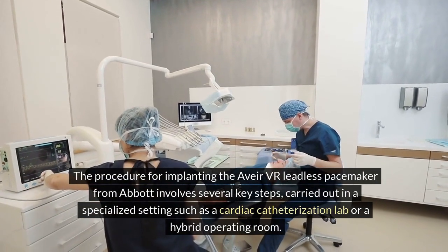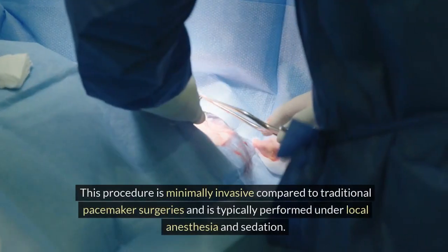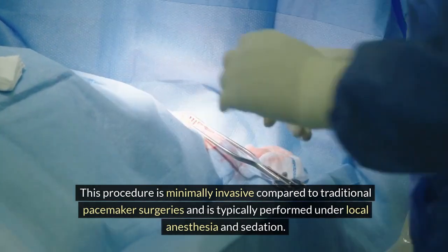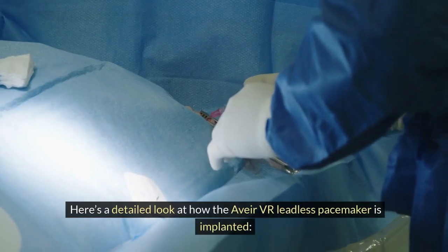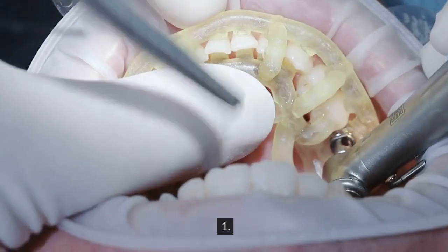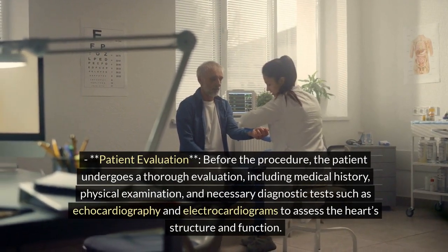The procedure is carried out in a specialized setting such as a cardiac catheterization lab or a hybrid operating room. It is minimally invasive compared to traditional pacemaker surgeries and is typically performed under local anesthesia and sedation. Here is a detailed look at how the Aveir VR leadless pacemaker is implanted.